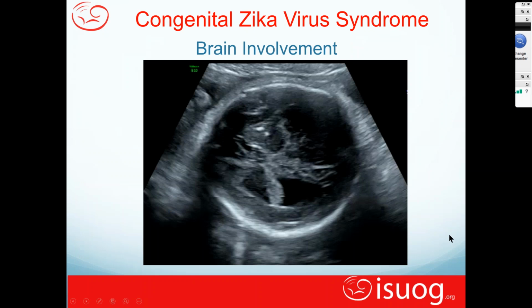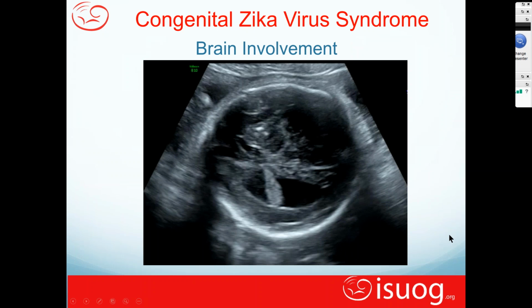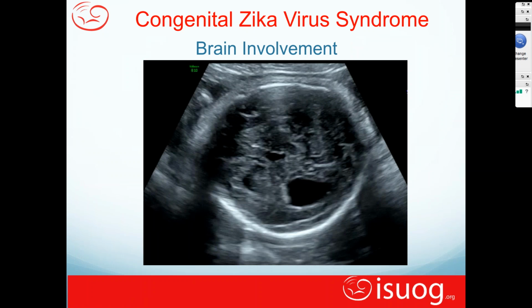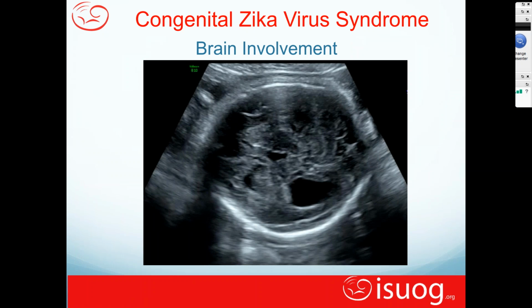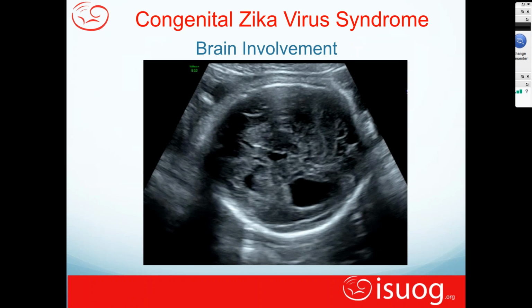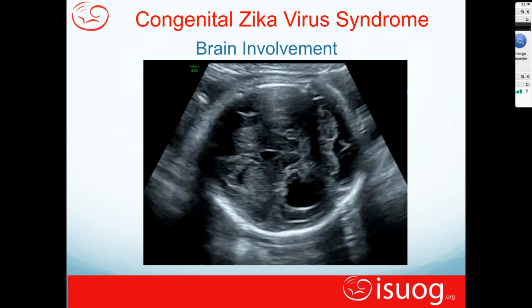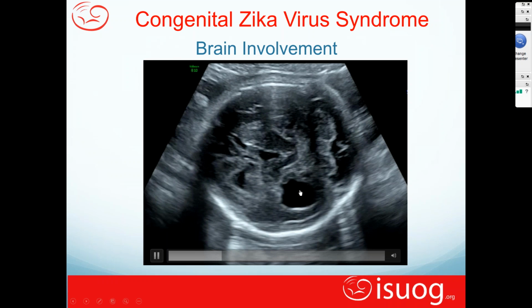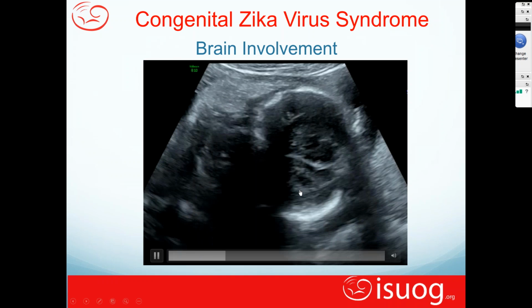Here's a video clip of brain involvement, and I'll go over it again once more, but strikingly there should be two things that you should all be able to recognize amongst the largest things that are strikingly here, besides the posterior area that you may see here. You see ventriculomegaly, and you also see the calcifications in the brain that are there.